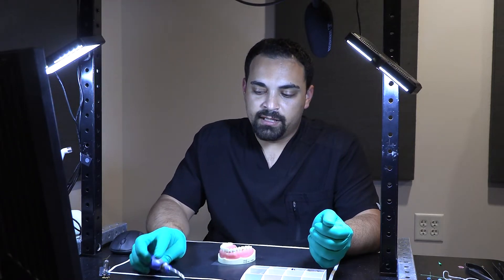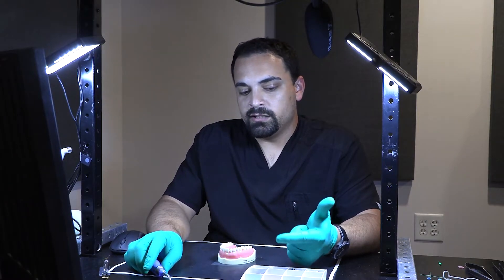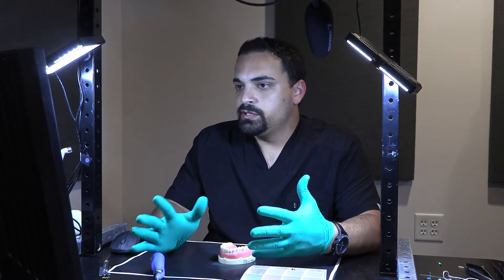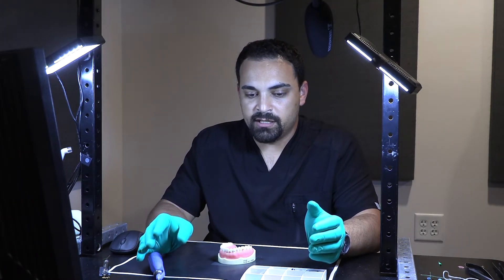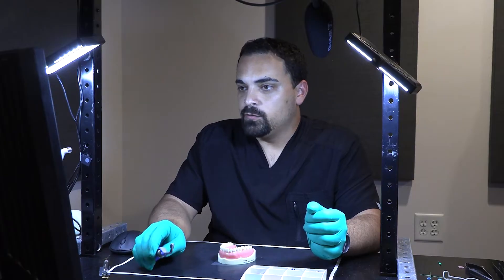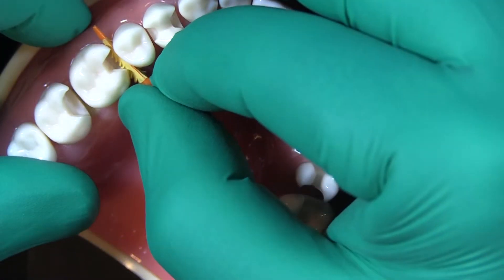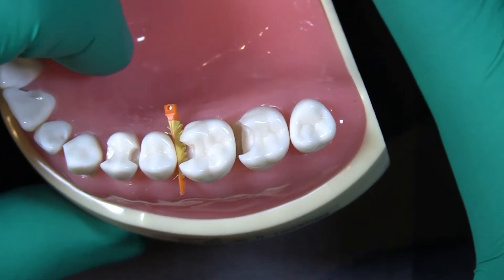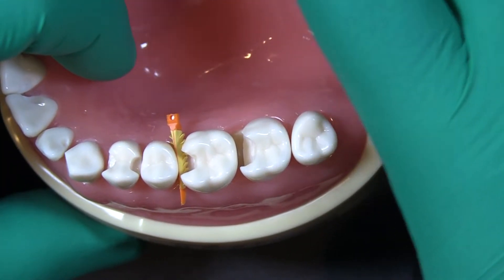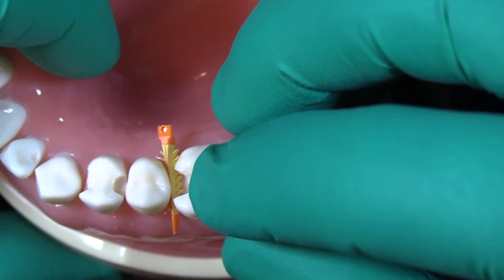The whole thing we're making sure we achieve here is isolation and good contour. Everybody knows we should use a rubber dam to keep that sealed and help with isolation, but we also want to make sure our matrix bands are putting pressure up against the tooth to create a seal as well. In this situation, the prep is sitting below where that wedge seats, meaning the wedge would be putting pressure on your matrix band up against the empty space of the preparation, not up against the tooth.